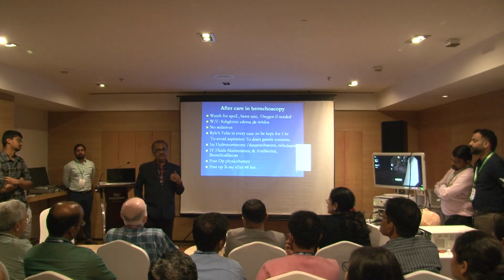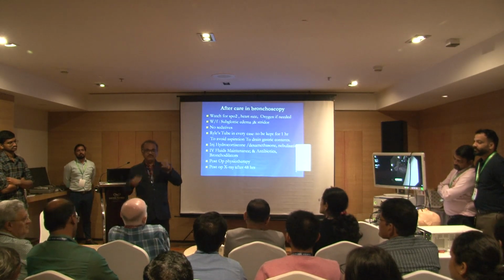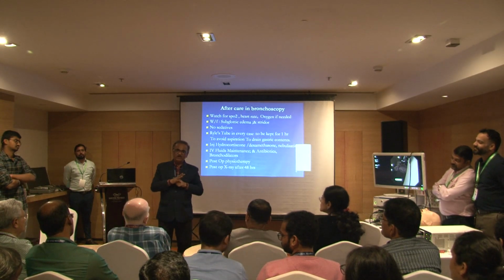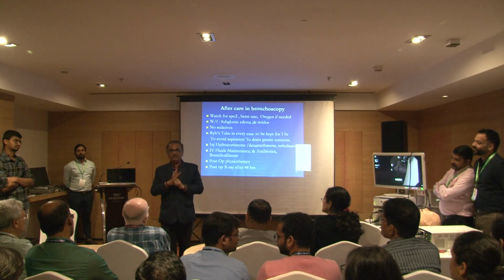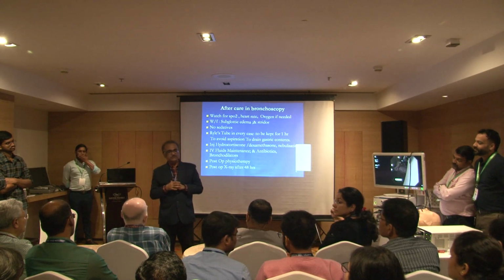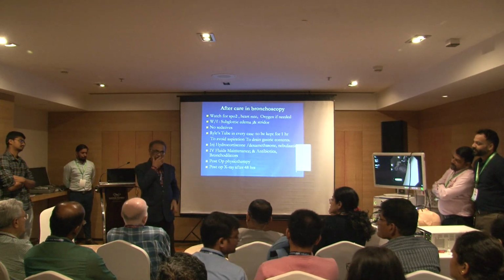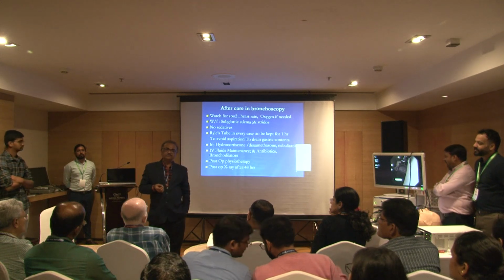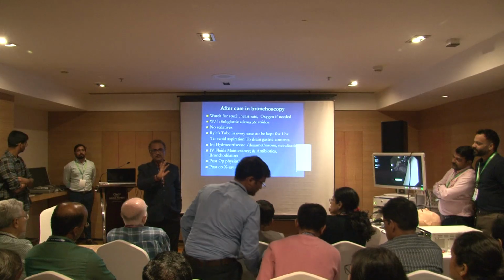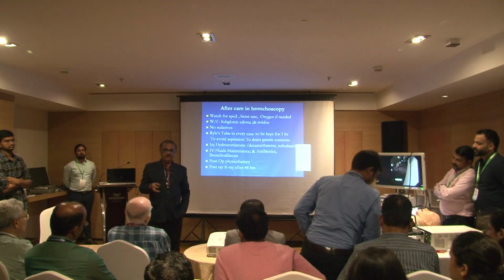Success rate increases with time over the years. The rate depends on whether you are a beginner or intermediate. So success rate now is very high, but for a beginner, I am telling you, sometimes the situations are very difficult and you feel really depressed. The thing is, if you are not able to remove it, put the foreign body there and again go in maybe 24, 48 hours later. So this is one.